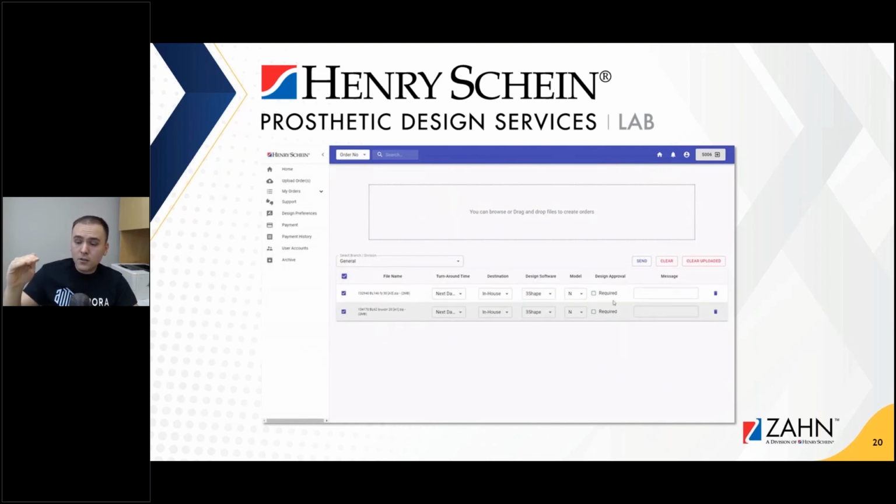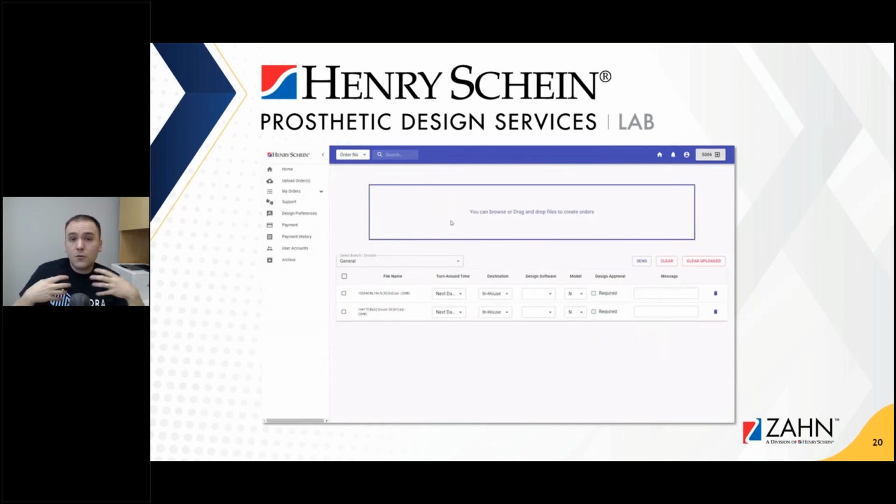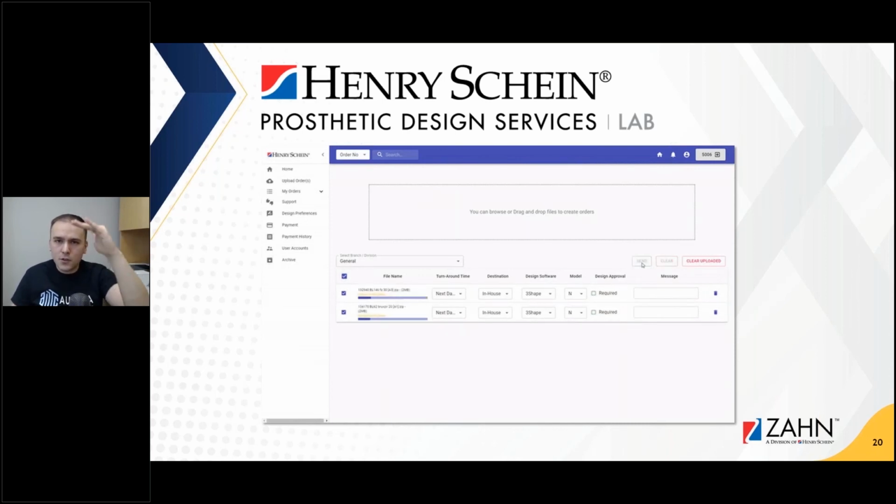This is very useful to have this kind of portal because you have very good visibility, so you don't have to reload a new page for every single case. This has always been a preferred platform for myself. Others might prefer something different, but I like to have the visibility of everything that I've uploaded and kind of like choose the materials on the fly and just send them to production.